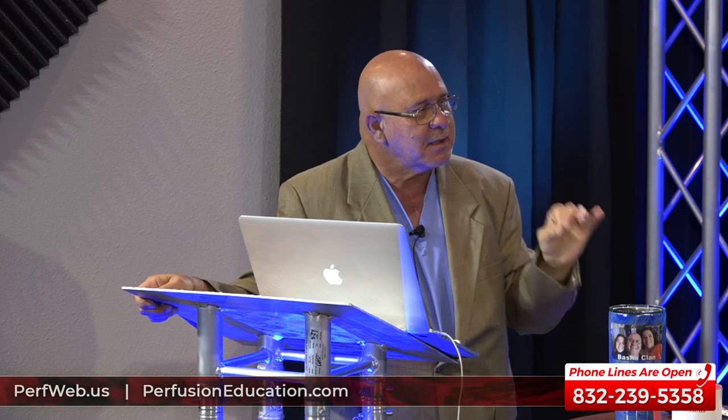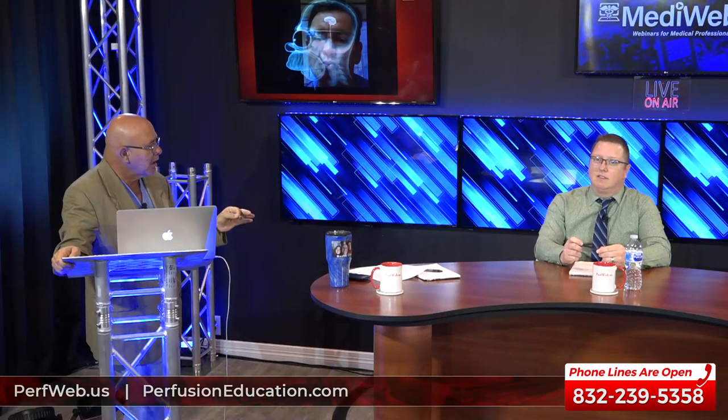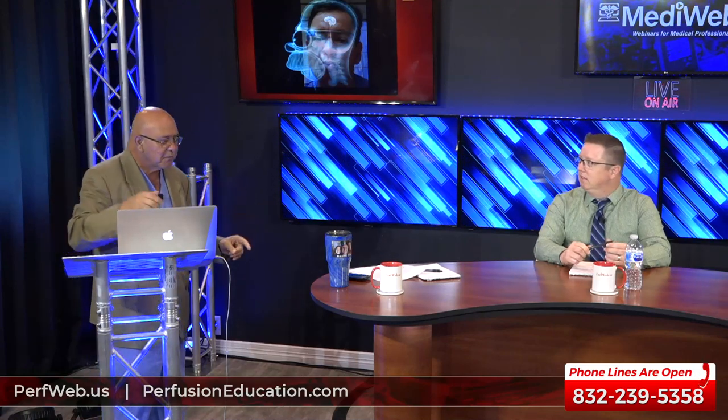If every time you did that, using cerebral oximetry, you saw major embolic events occur, but when you turn the flow down by reducing the RPMs of the pump, the rheostat control, and then come back up, you didn't see that, would you change your practice? Yes, you would, because you'd have proof. Does it happen? I don't know.